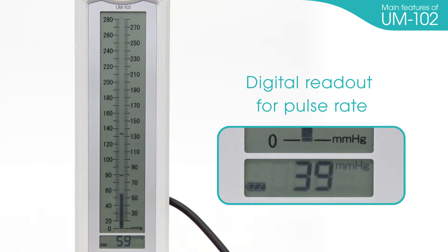Digital readout for pulse rate. After measurement, pulse rate can be shown on the LCD display.